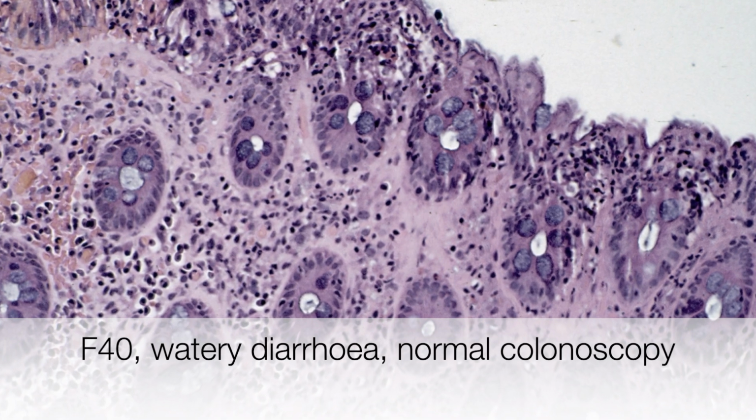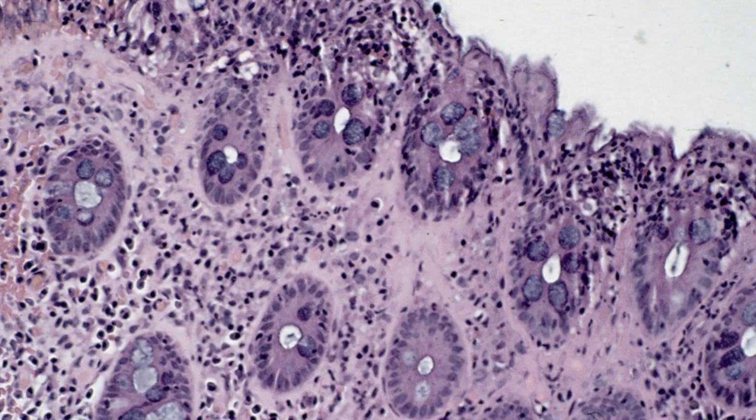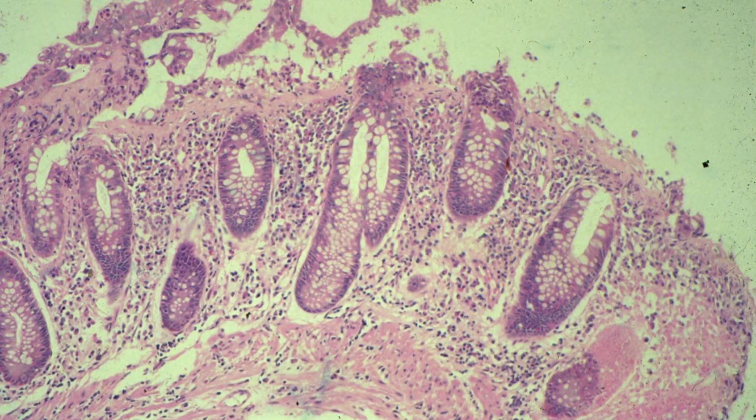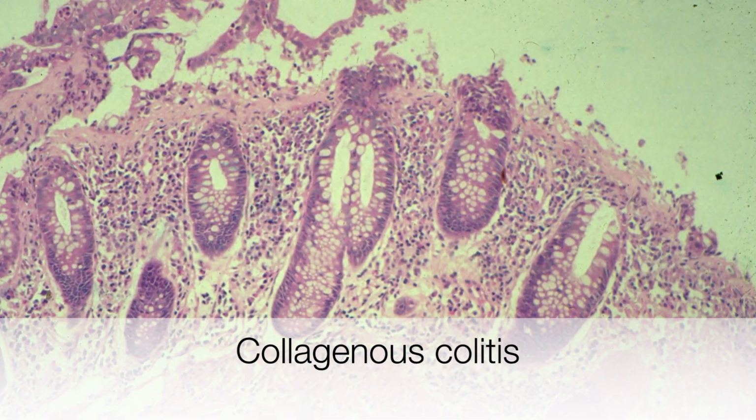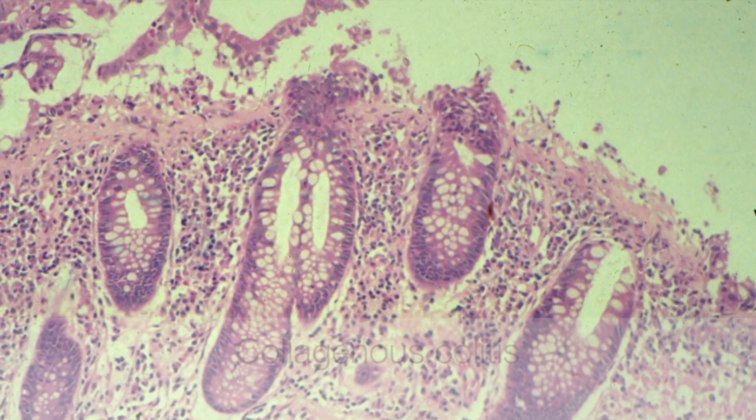The fourth case was a patient with watery diarrhea, and this colonic biopsy shows features of collagenous colitis. The link to the video about collagenous colitis is above.